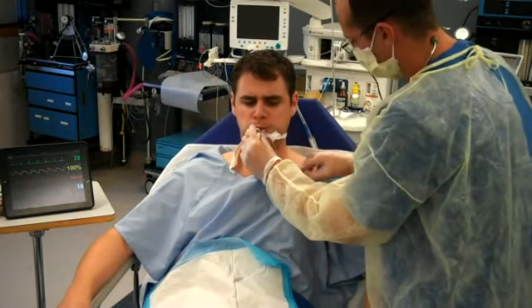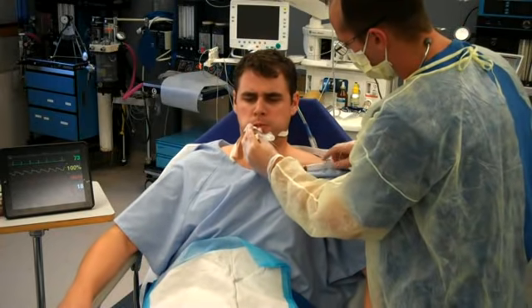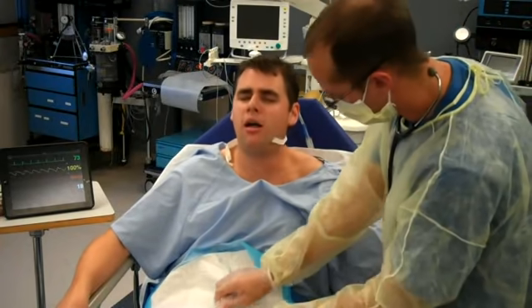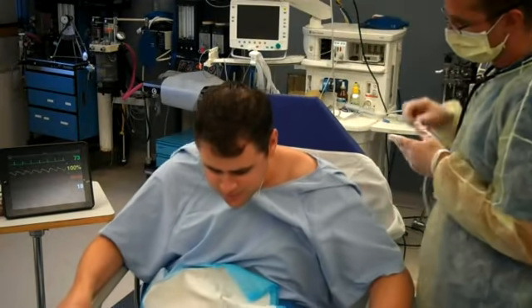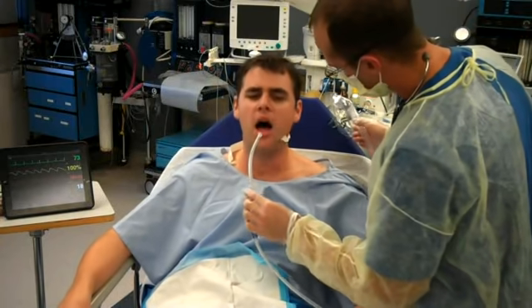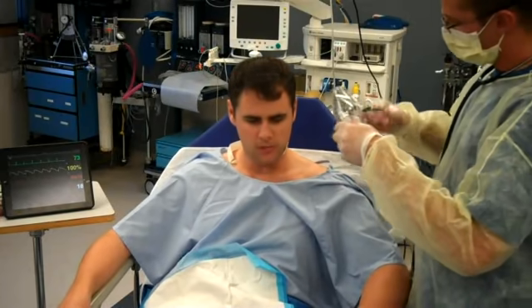Okay, the breathing machine — what I want you to do is take a nice deep breath in for me. Perfect. And one more — one more nice big breath in. Pop that stuff all up. Take your hand in your mouth there, pop that up. I'm going to put you on some oxygen here.